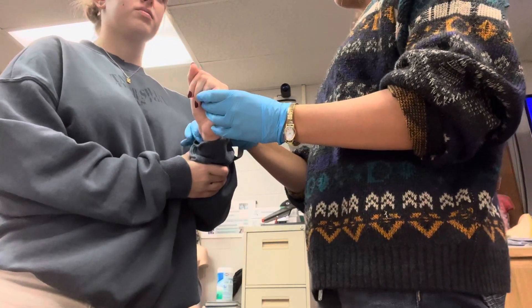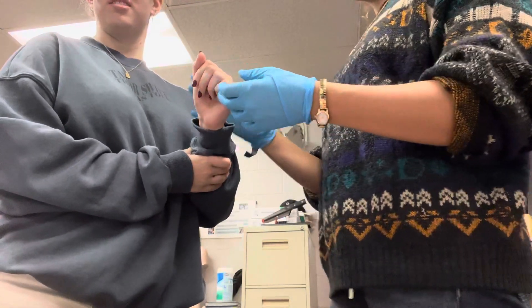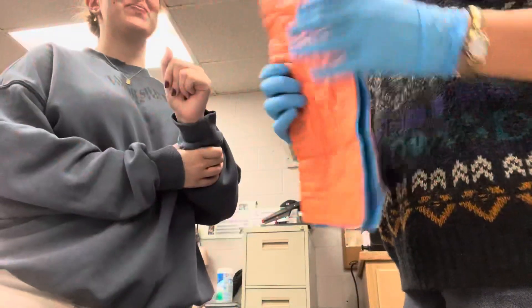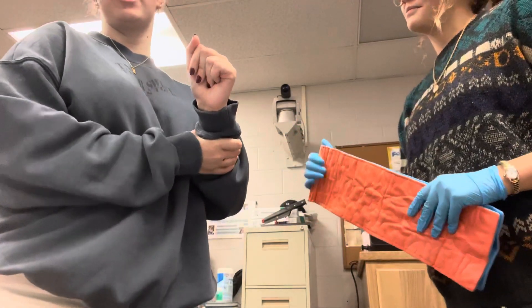I'm going to assess CMS. Check for a pulse. I feel a pulse. Yes. Can I have a wiggle for you, ma'am? Good. And then what finger am I touching? Thank you. Good. Motor, sensory, and circulatory functions are present and normal.